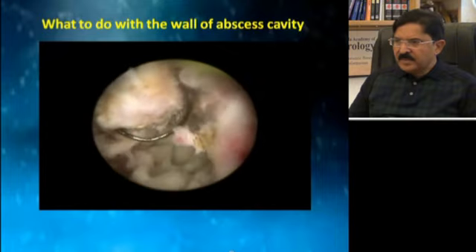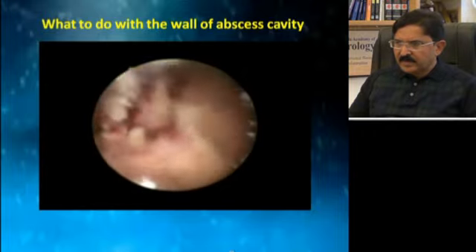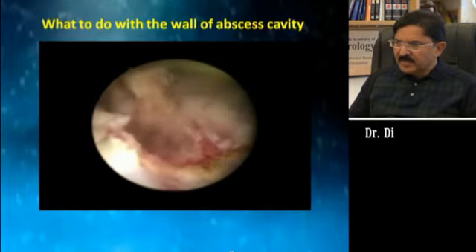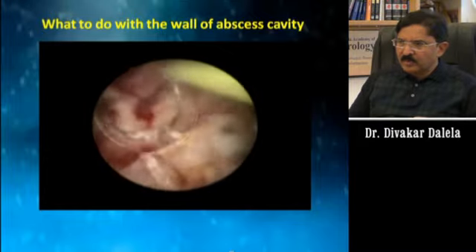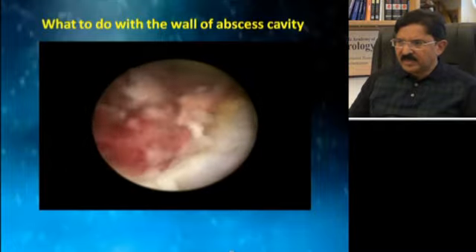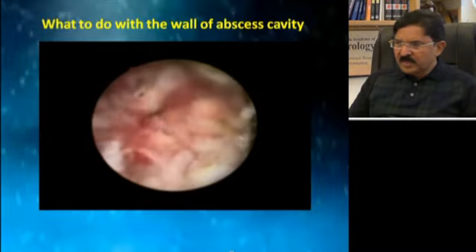As you go in the abscess cavity, you mop this abscess by the loop, shave off the entire pus that is adhered to the wall of the prostate cavity, and then you may notice a small teeny point from where the pus is coming. Just by the loop excursion, try to open the hole. If need be, small tip resection can be done. Move the loop a couple of times, put pressure on the wall. By the pressure, you can squeeze the pus out.